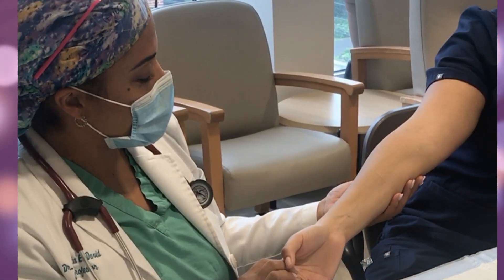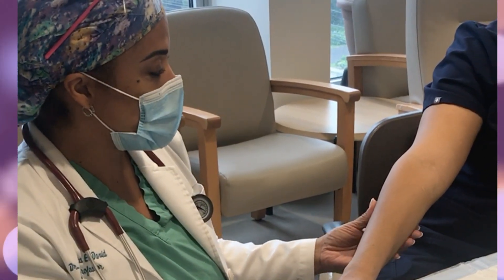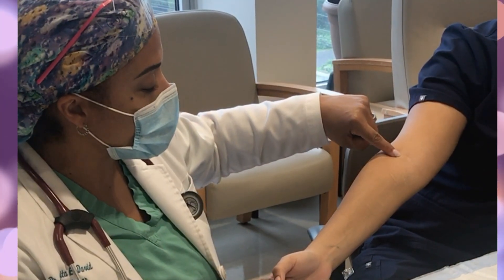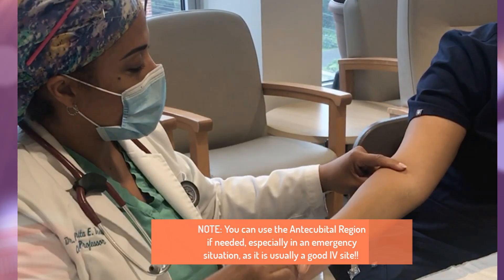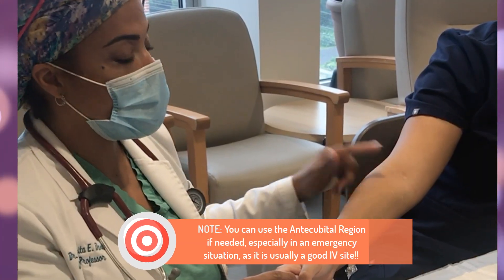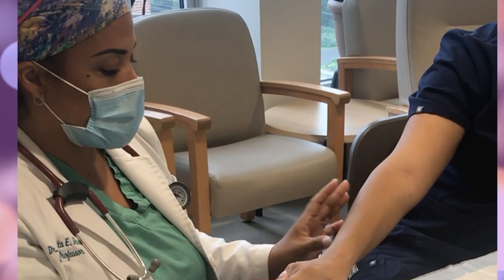The first thing you want to see is where the patient has a good vein in order to place an IV site that's going to last. I usually do not go to the antecubital if the patient is going to be admitted, because a lot of times when they bend their arm, that IV site bends — since it is a plastic catheter — so you're going to hear a lot of beeping from the pump. I tend to look at the forearm first.